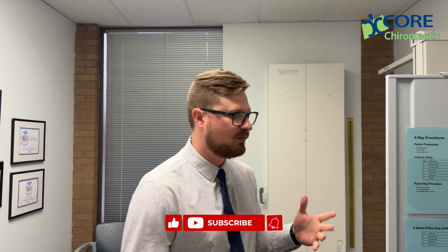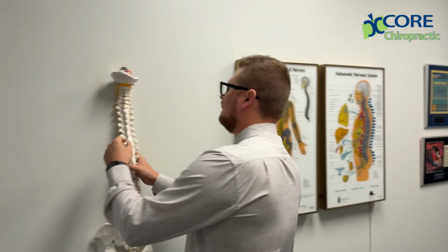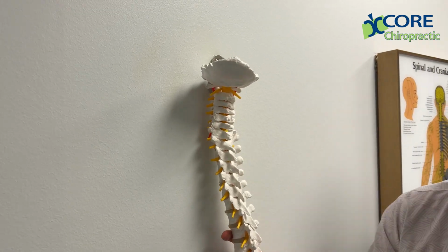We need to see exactly where that curve is in the neck. So if we look here from the side, what we want to see in the neck is a 35-degree curve. That 35-degree curve is really important. It allows for gravity and the weight of our head to be pushing on those disc spaces evenly and appropriately, because when it's not, and we have forward head posture or we've lost that curve, there's more gravity pushing on those disc spaces and it wears down over time, and that causes degeneration. And then when that degeneration happens and there's less space here on these nerves from the neck, it's going to put pressure on those nerves. And that's what's really causing all of our pain and all of our discomfort.